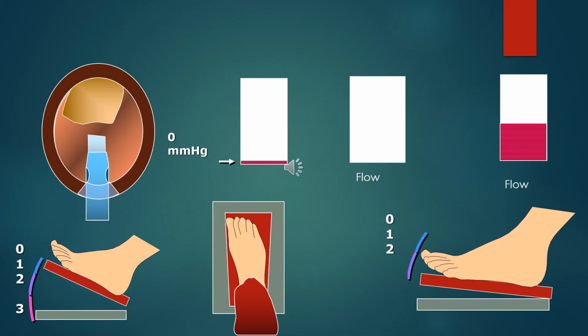As it breaks, the occlusion is lost. The phaco tip is not blocked now. The nucleus piece, which was so long blocking the tip, is broken. And more fluid is now drawn from the eye because the pump starts rotating again. As the pump starts rotating again, those nucleus pieces which have been hit and which have cracked and become smaller will be drawn through the phaco tip and got rid from the eye. So that's actually the process of phacoemulsification.